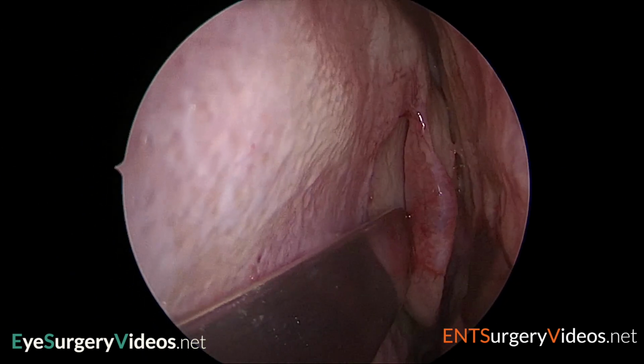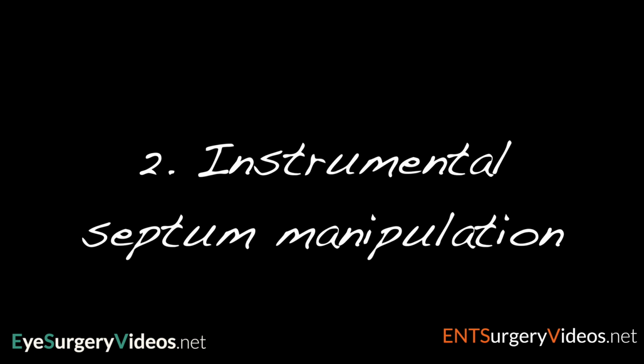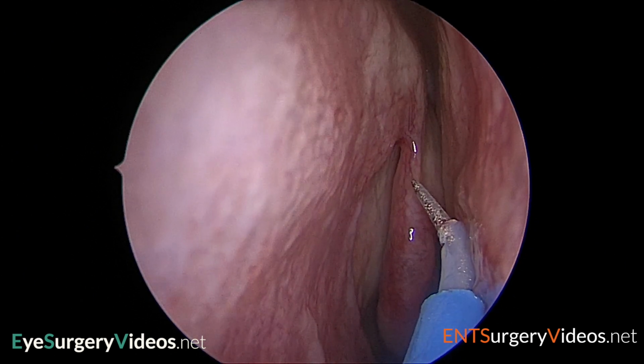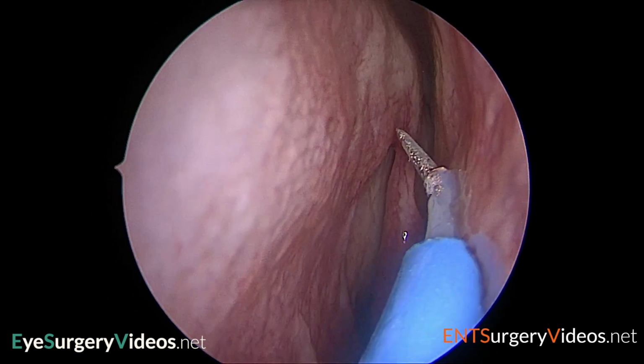The nasal septum can also be gently shifted with the heel of whichever instrument is being used, for example the monopolar diathermy shaft during mucosal flap creation.